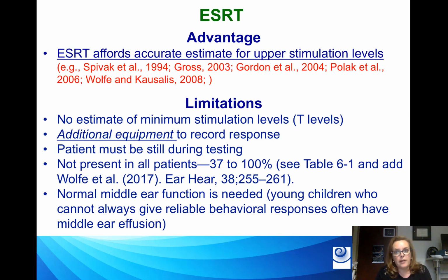A big one, of course, is the patient has to be still. And if you've worked with your patients and they for years have pointed to the loudness chart or have raised their hand, it takes a little bit of counseling to teach them, like, I don't need to know every time you hear it, because a lot of them will want to go, that's a 6, or that's loud but comfortable, and then of course it destroys that response because the compliance goes all over the place.